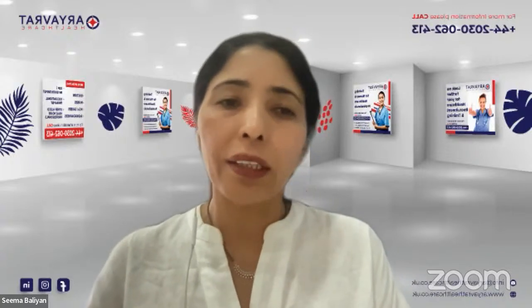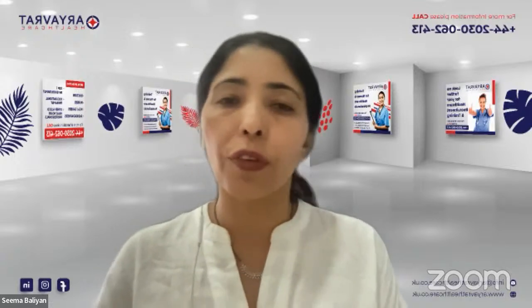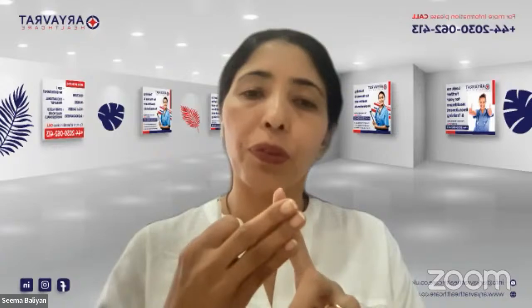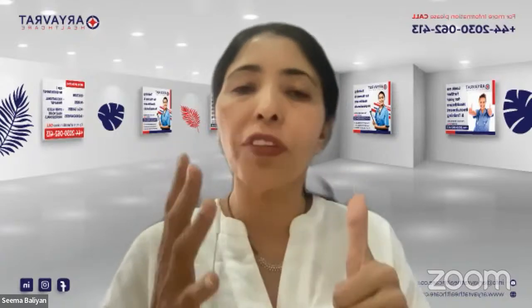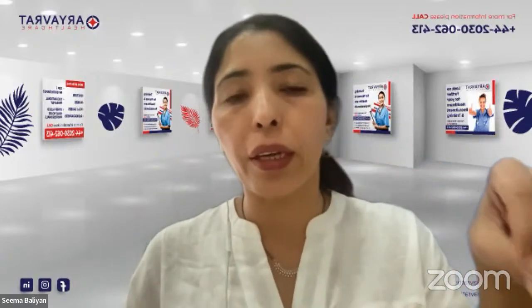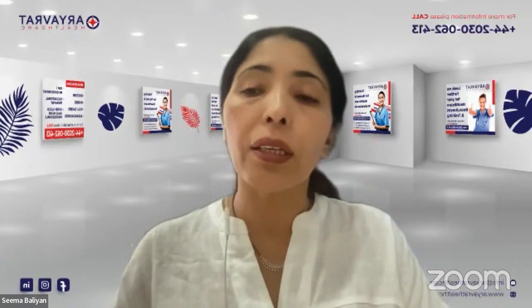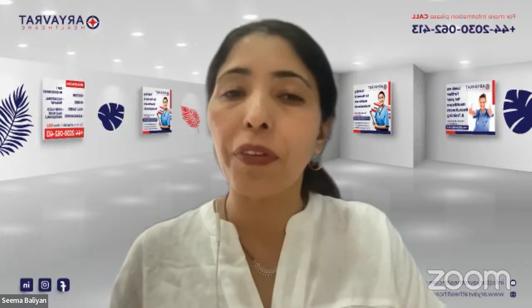So in the inhaler station, along with all the things that we have already discussed for the peak flow, we will need to do the what and why, the parts, the position, the procedure, and the maintenance. Along with these 6 things, there is one more thing which is very, very important in the inhalers. Now remember, inhalers are also a medicine. So you are giving the medicine through the inhaled route. So what are the principles that we will need to follow?